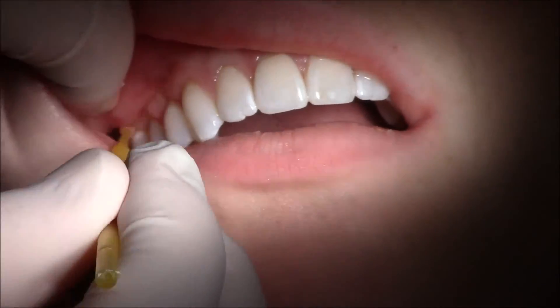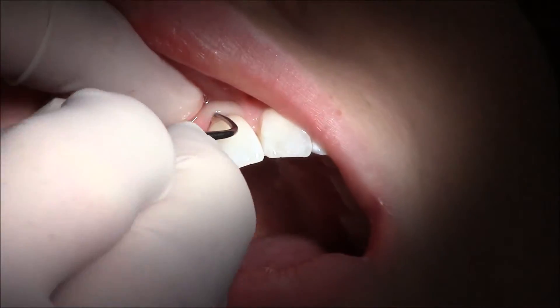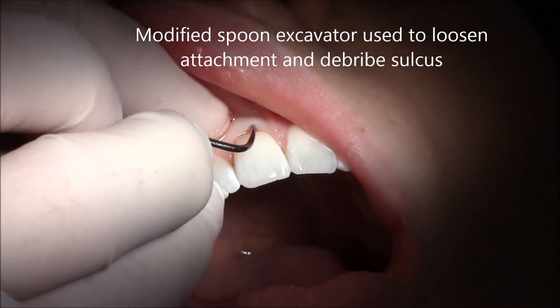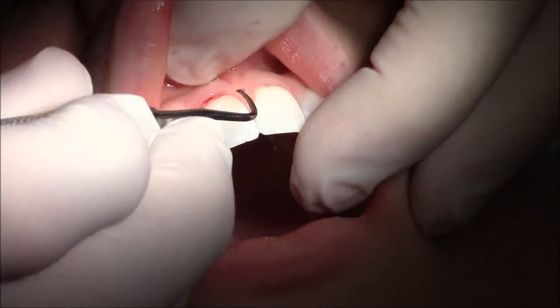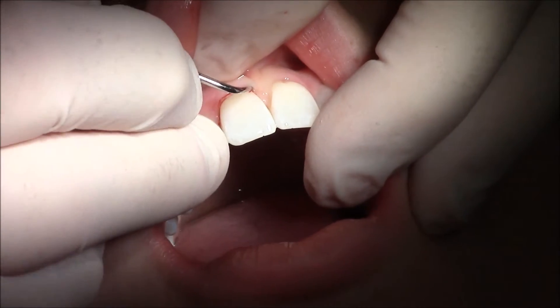Using chlorhexidine we disinfect the gum tissue and the exposed root. After that we follow through with a modified instrument that loosens this attachment and allows us to clean out the sulcus and remove any debris we might find, although normally all this is very clean before we start.